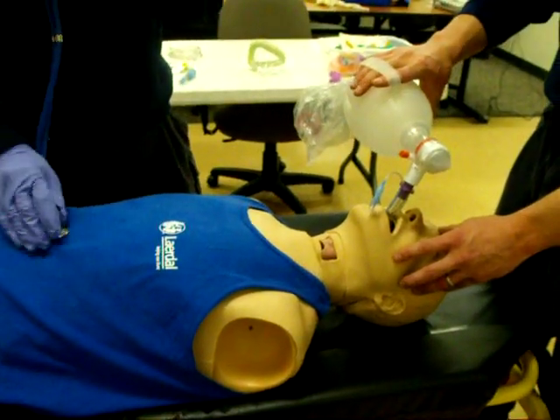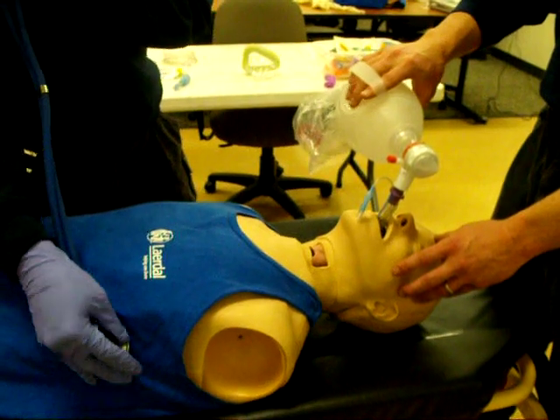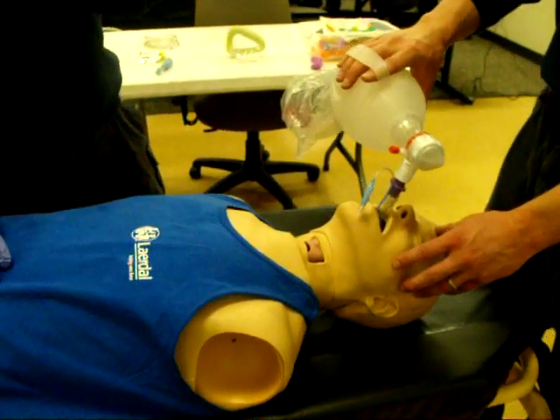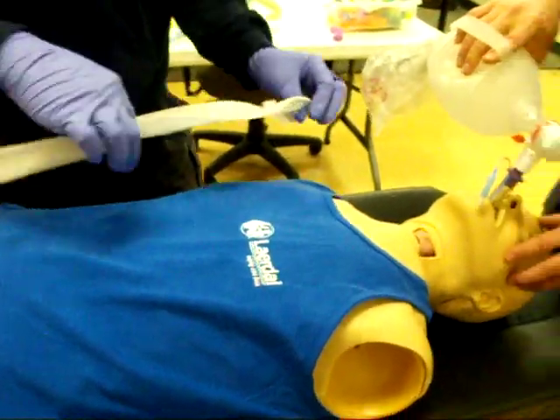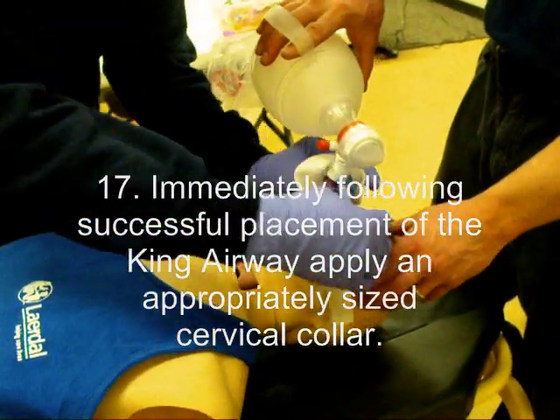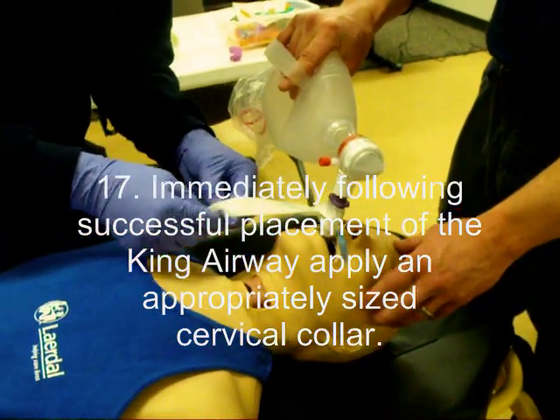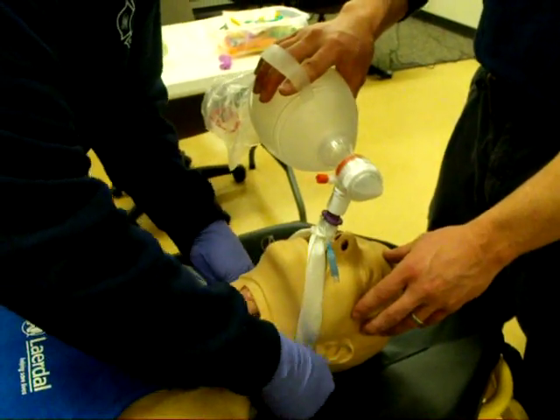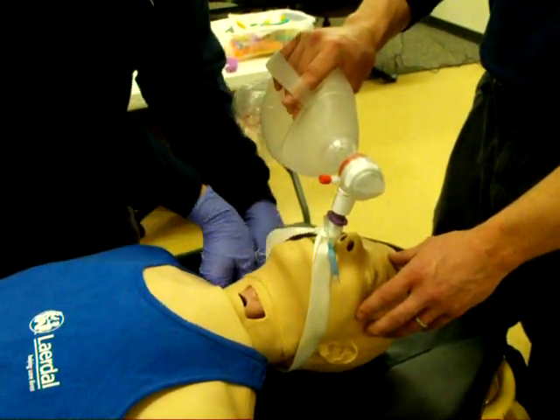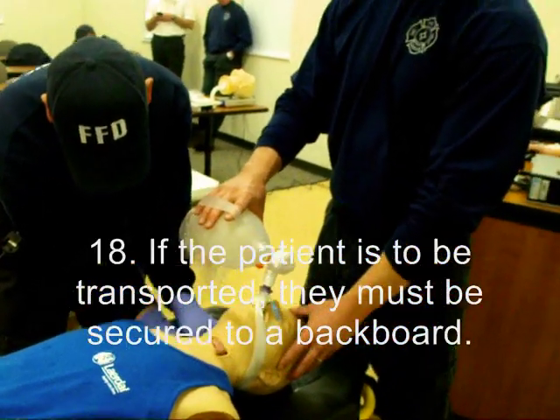Immediately following the successful placement of the King airway, apply an appropriately sized cervical collar. In the event a C-collar will not fit, manual inline stabilization should be utilized if transported. Blankets, towels, and tape should be used appropriately to restrict cervical spinal motion. No exceptions to this rule. If the patient is to be transported, they must be secured to a backboard as well.